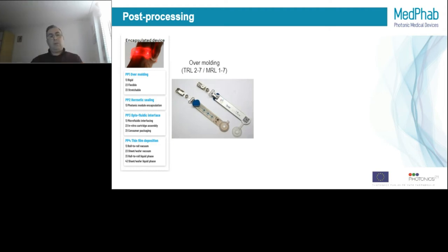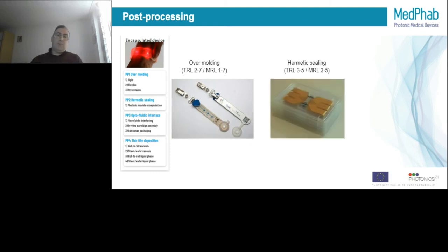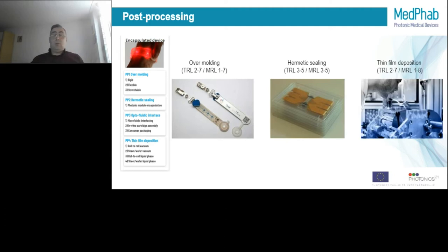So further on, we speak about post-processing, in which basically we speak about, let's say, overmolding, when you protect your electronic devices, whether printed or done in a classical silicon way, in a kind of hermetic sealing or proper sealing to avoid any kind of moisture or water. Then we speak about hermetic sealing, sometimes very important if we are speaking about implants or electronics going into the vital organs in vitro or in vivo, and basically we can solder or we can seal the one or many blocks, and of course thin film deposition, where we can print with high throughput and cost-effective technologies like inkjet printing, gravure printing, flexo, and so on.